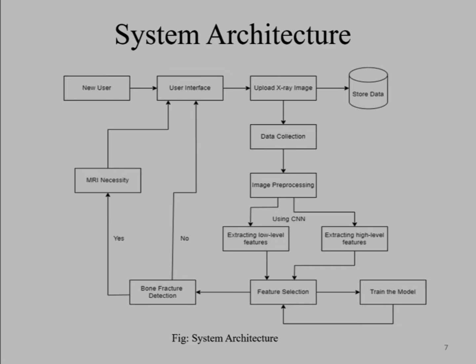Feature selection. Once features are extracted, we filter out the irrelevant ones. This helps focus on the most critical data needed for accurate fracture detection, reducing unnecessary computation and improving efficiency.